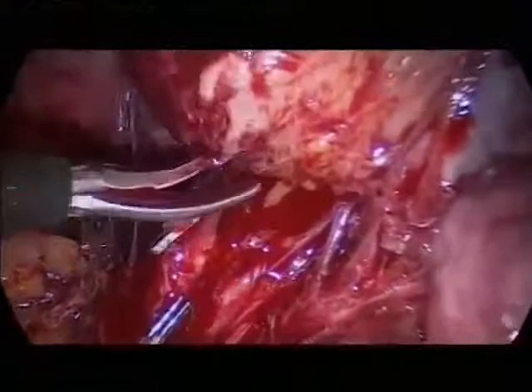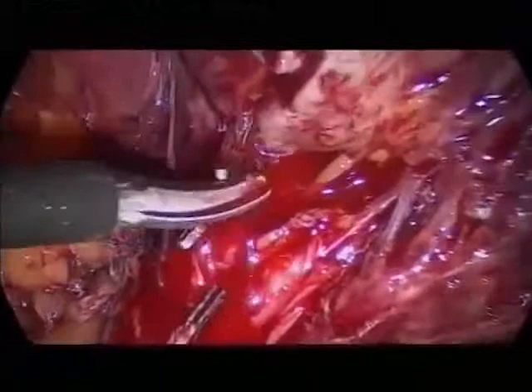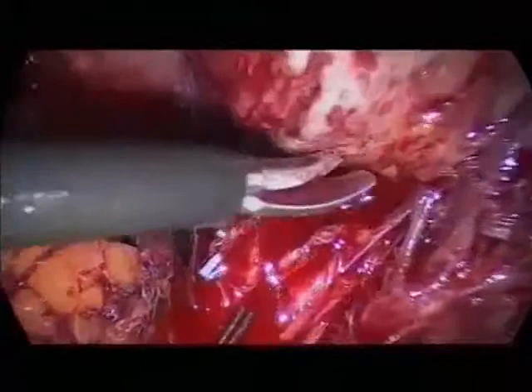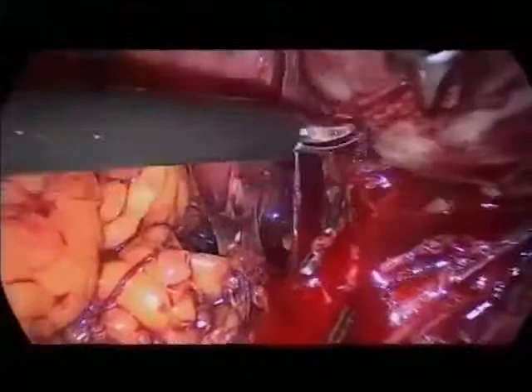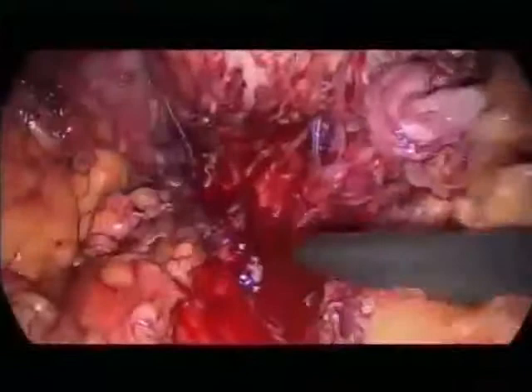All of us know that we actually can't see many nerves. So for this reason, it is important to have something where we can orientate. And I think the capsule of the prostate is a very nice structure for orientation. And what we do, we dissect directly on the surface. You see it on the surface. This is capsule on the surface of the prostatic capsule. And for this reason, this gives us a kind of orientation. I hope this is understandable.